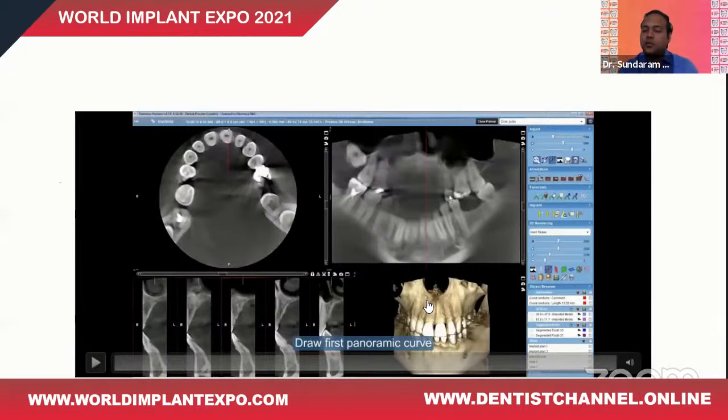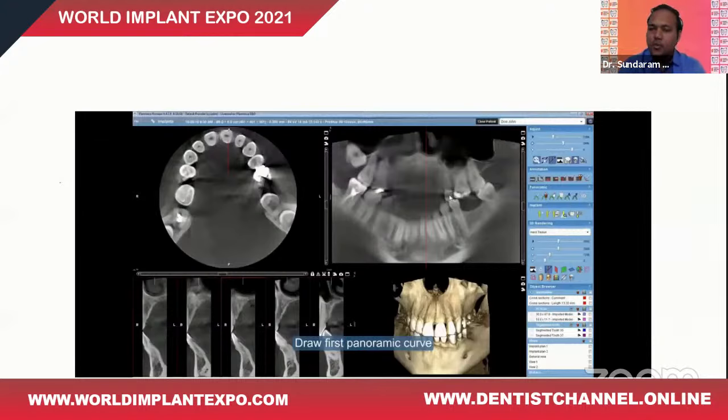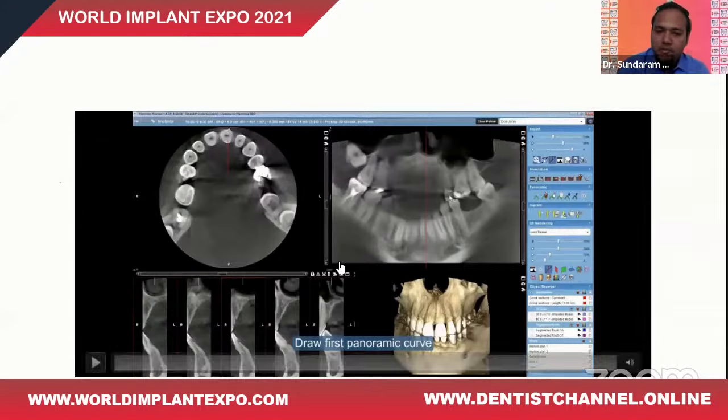Now this is a video representation. It's a pre-recorded video presentation of how to handle a CBCT when you receive one. So let me take you through this video.